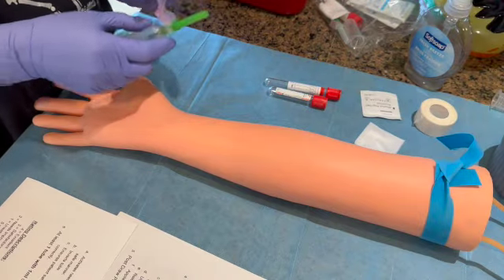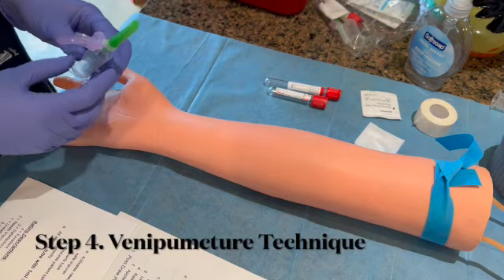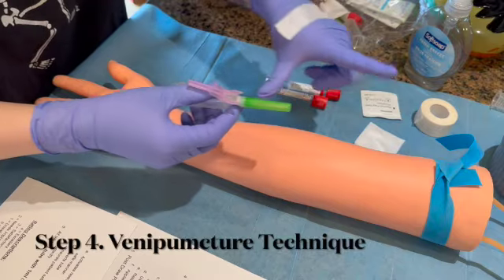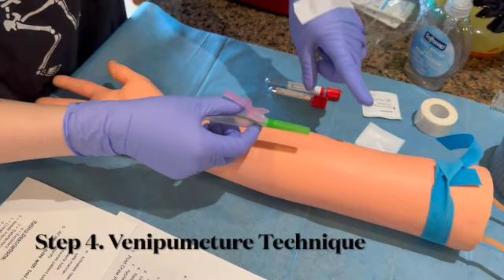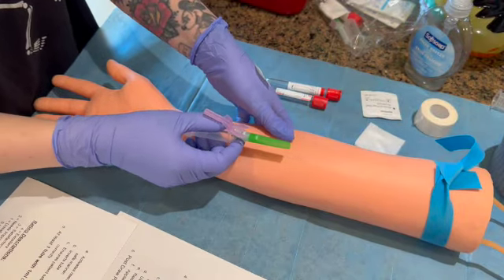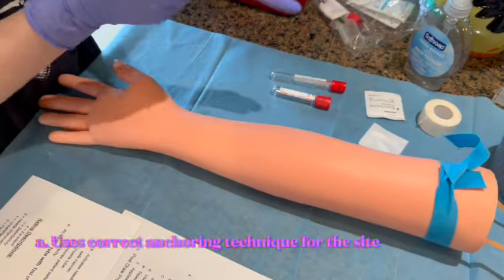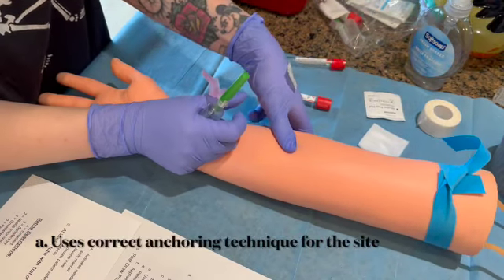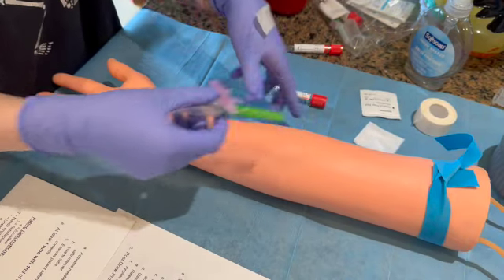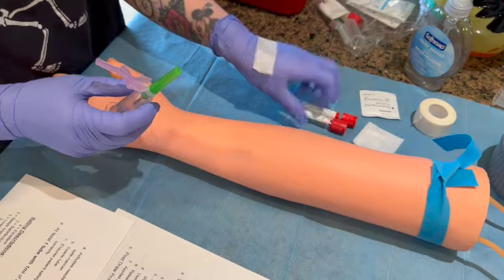Site looks clean. So at this point, we're going into number 4, the venipuncture technique, which step 1 is using correct anchoring for the site. So as we know, that does not mean the C. I want my finger nowhere near where the top of the needle is going to be. And so I'm going to be going into this cubital vein here. So he's not very easy to anchor, but we're going to be anchoring the site as best as we can, well below where we're going to be performing the venipuncture. I want my thumbs out of the way, so I'll be anchoring further down and preparing that here.